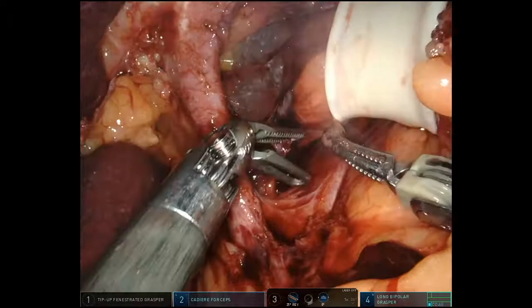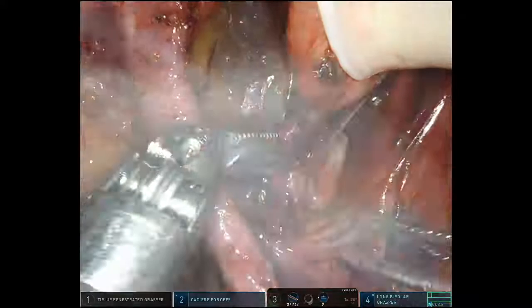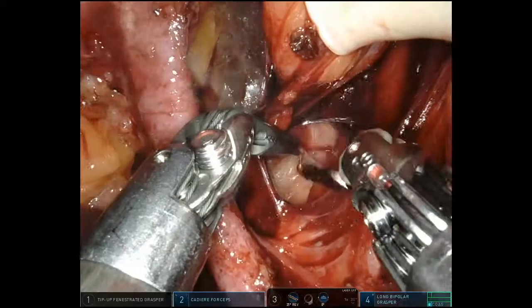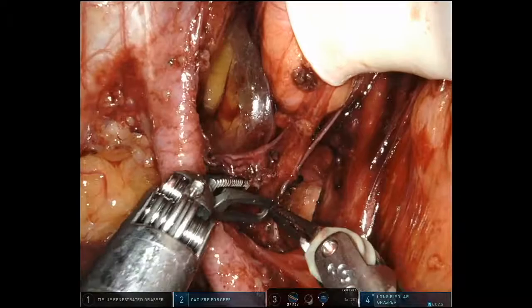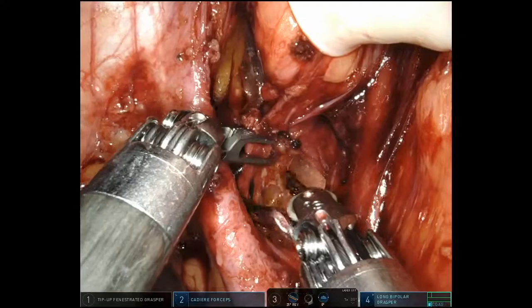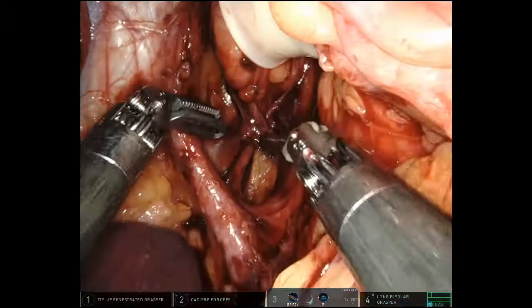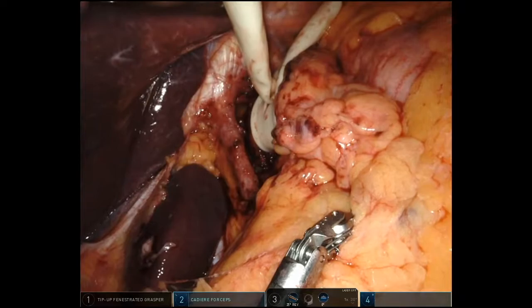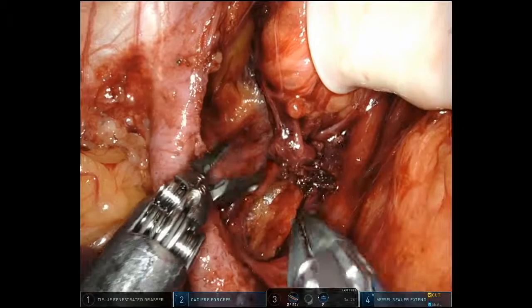This is where we get length on the esophagus, and for me this is when you see the true advantage of the robotic approach — mainly the visualization, which is so good — but also being able to go way up into the posterior mediastinum and get lost to length on the esophagus. I think I punctured into the right pleural space there. At this point I'm talking to my anesthesiologist: keep an eye on airway pressures, check hemodynamics. If I need to put in a little pigtail chest tube to decompress, I scrub in quickly and use one of those Wayne pneumothorax kits at the bedside. This patient was doing fine, as most will.